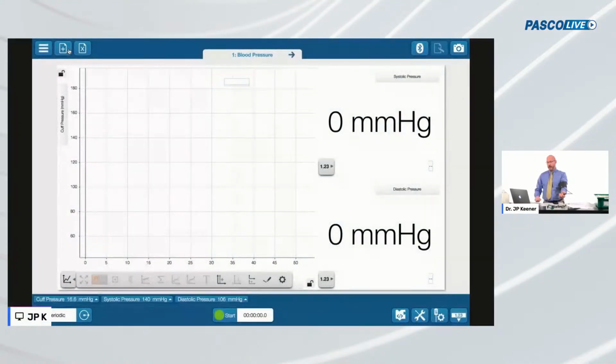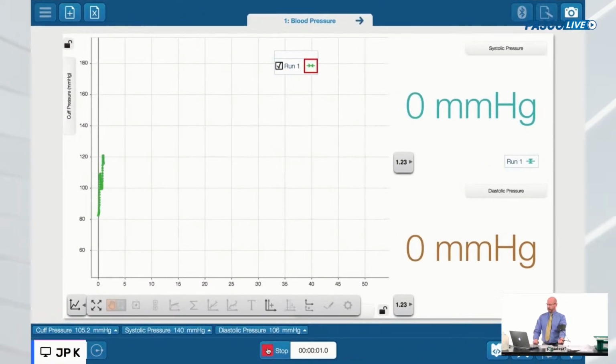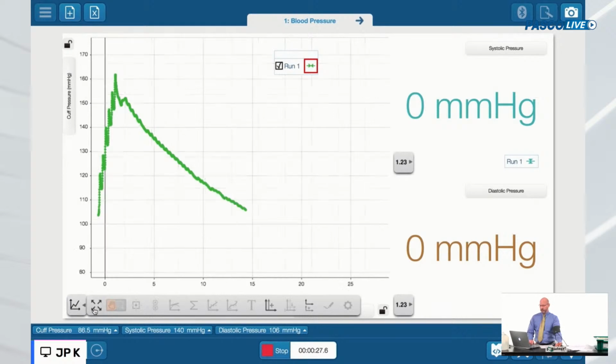Now, take a look at my screen. I've already set up a program here that is helping me measure the systolic and the diastolic pressure. And we're going to do this live, and hopefully my talking through this isn't going to screw it up too much, but watch me pump up my device here, and let's let the pressure go down. On your screen, you should be seeing my heartbeats, and those beats are exactly what it's measuring, the point at which the cuff pressure is the same as my high pressure, and the cuff pressure is the same as my low pressure. Let me see what comes up here as we expand this out and look at those numbers.